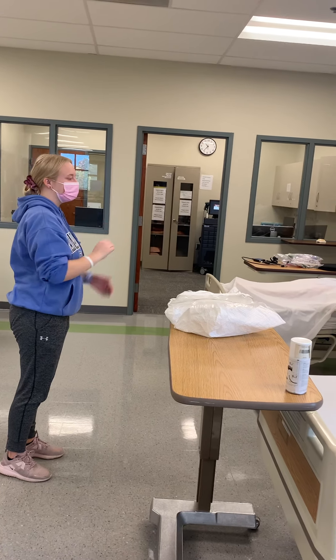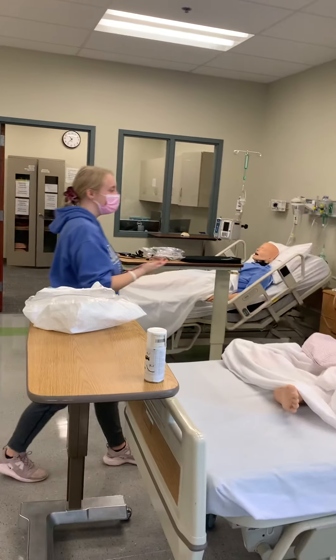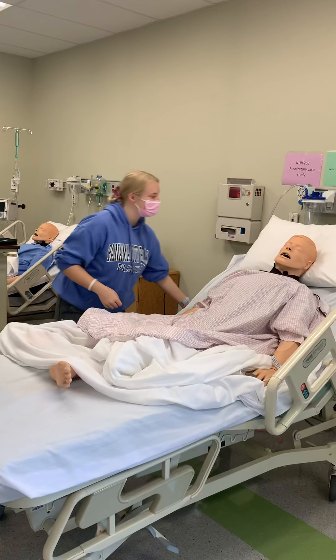Knock, knock, knock. Hand hygiene. Hi, Mr. Everett. My name is Courtney. I'm going to be your nurse today.